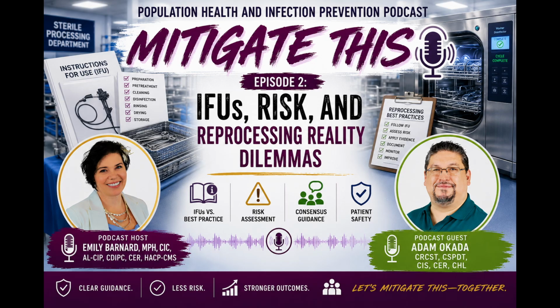So would you be able to talk about FDA and medical devices, particularly the different grades and how they apply to the devices today? So medical devices actually started, I think, in the 1930s. There was a statute that the FDA got regulation and oversight over medical products. And then the Medical Device Amendment Act was in 1976, where they really created the three-class risk-based classification system for medical devices. And they also established regulatory pathways for medical devices.